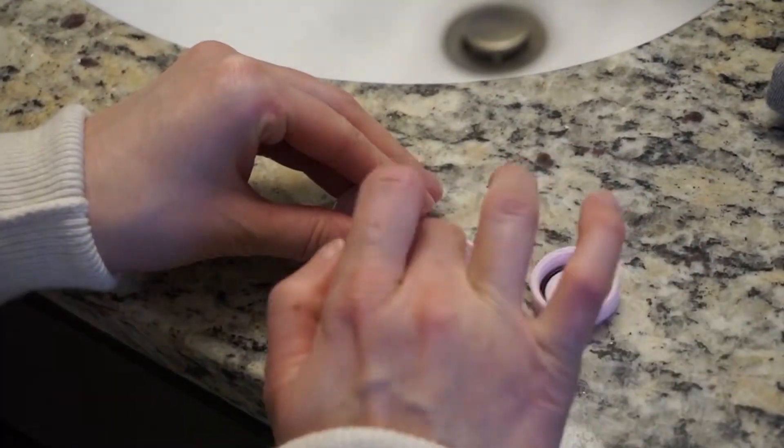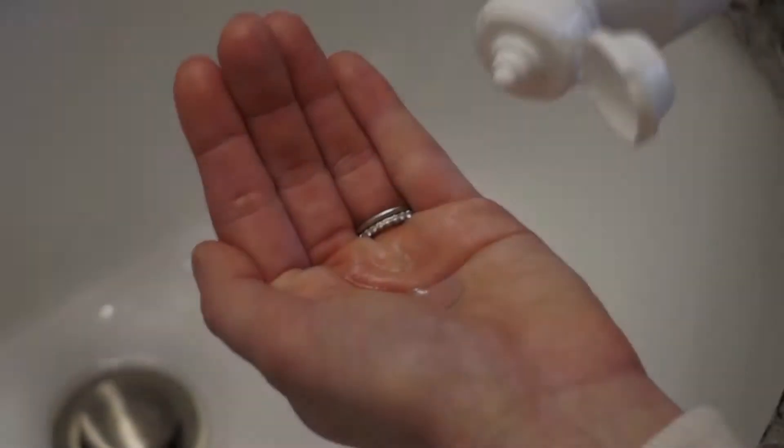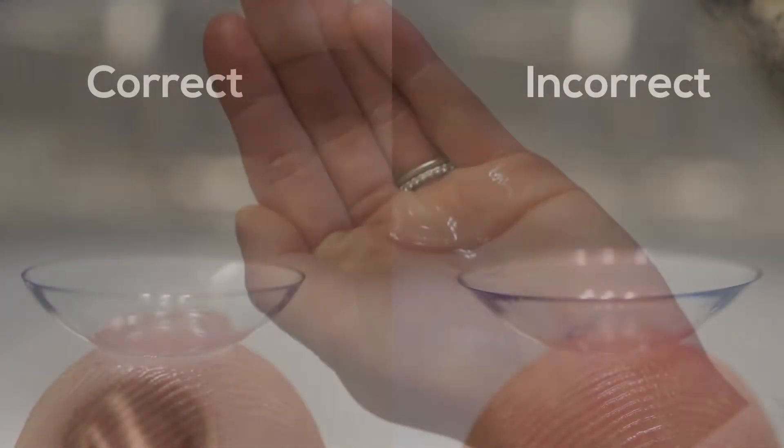Step 3: Remove your contact lens from its package or case. If you wear contact lenses stored in a case, rinse them off with contact lens solution.